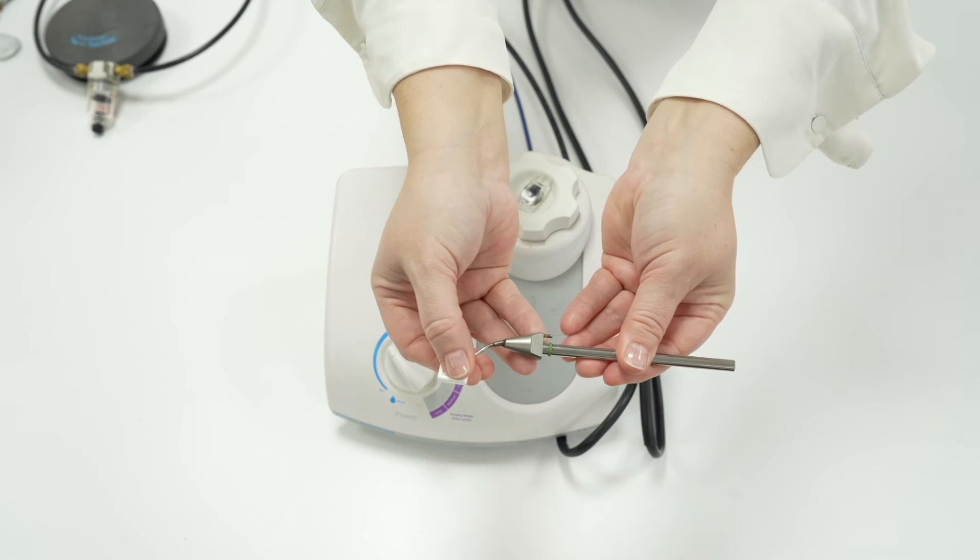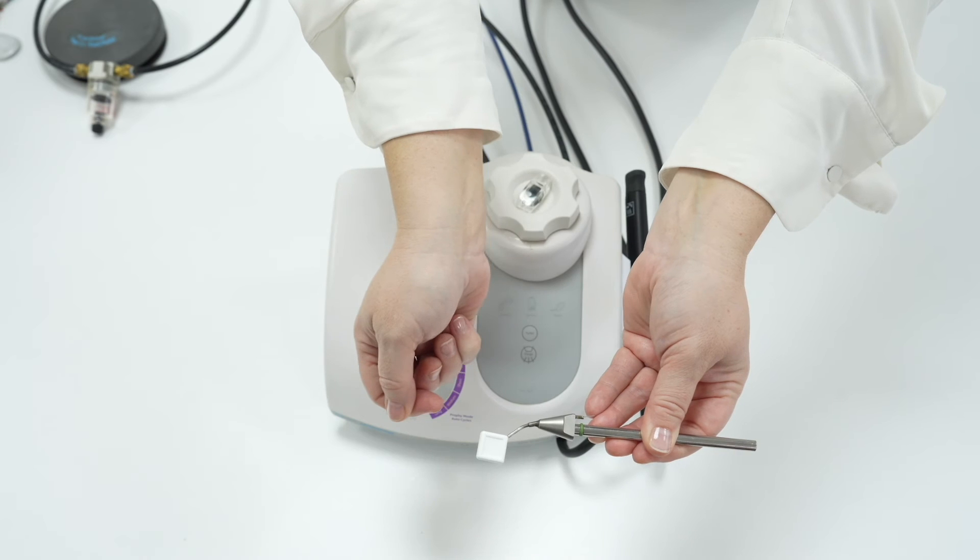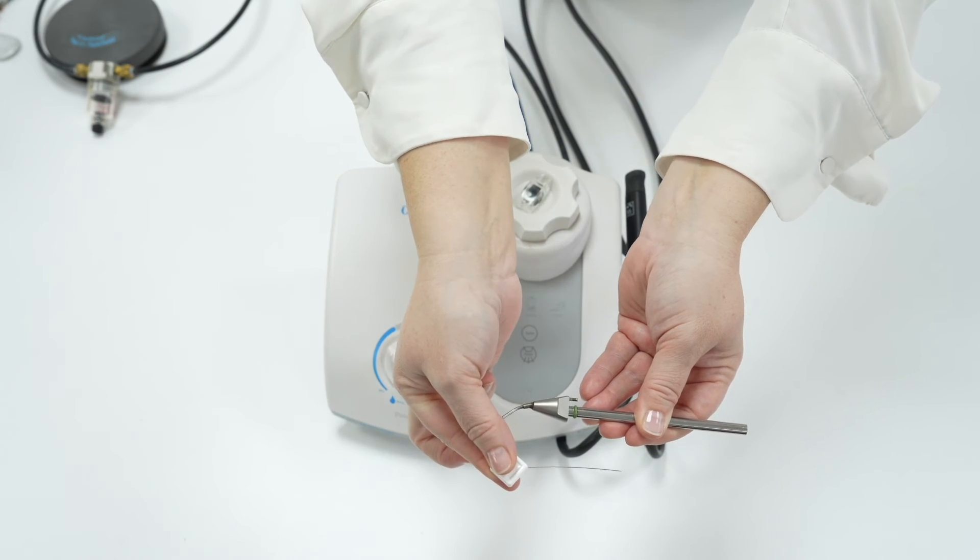The profi insert should always have the cleaning rod inserted, keeping it unblocked. This should be inserted after use and whilst autoclaved and not removed until the insert is ready to be used again.